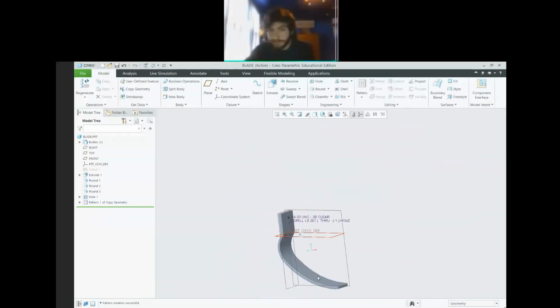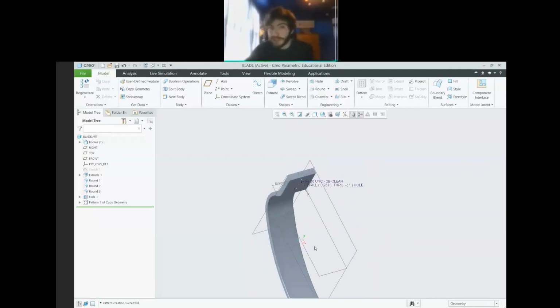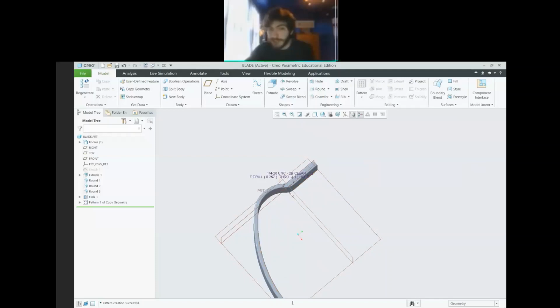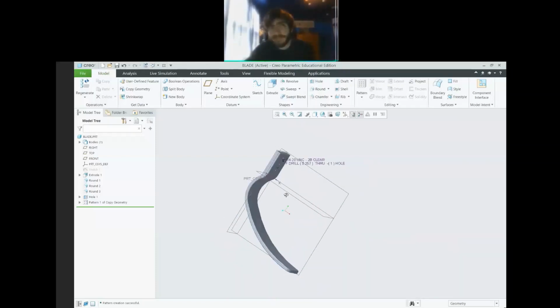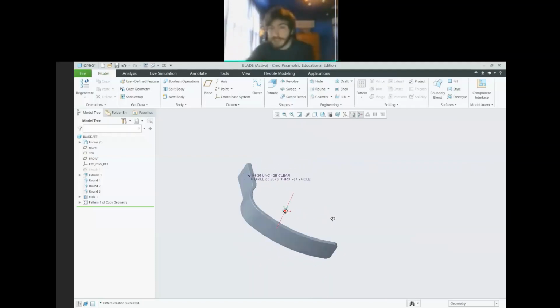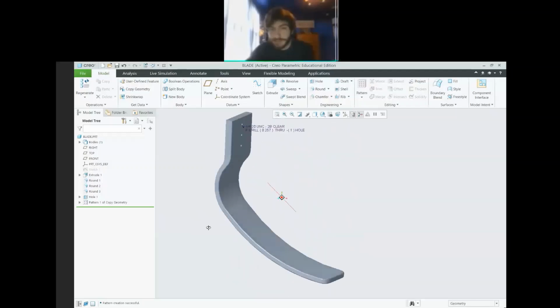And there we go. That's one way to make a Cheetah blade. If you're familiar with other programs, this could also very easily be done with a sweep, right? So we create one line that we're going to trace with, just a square profile. You could also do it by making a sketch, the same thing we did, extruding it left and right as a surface, and then thickening the surface. Yeah. But this is, I think, probably the easiest and most straightforward way to go about it.